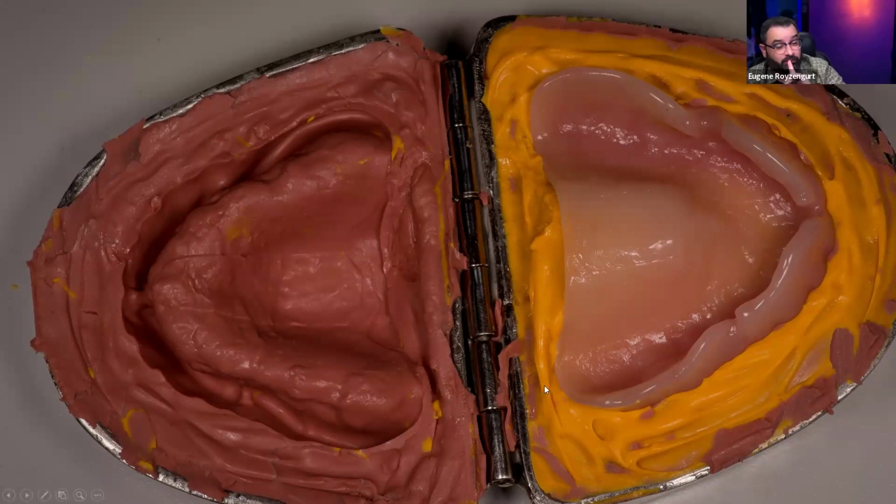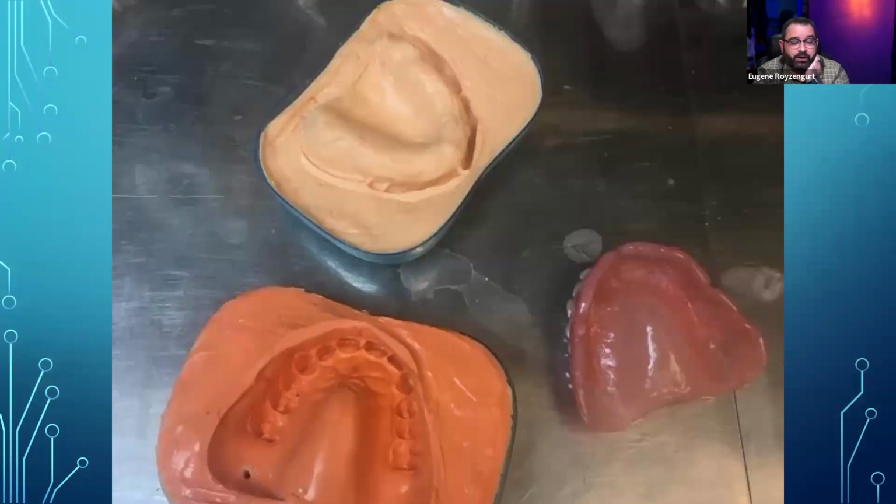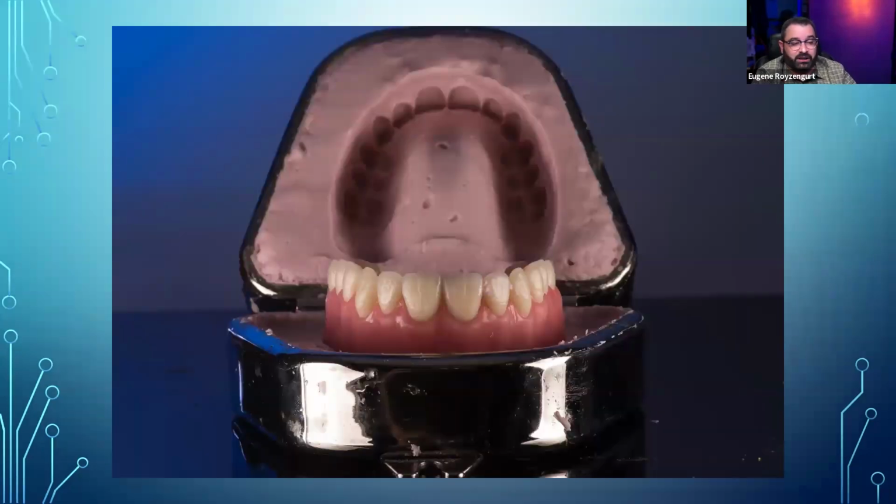Important thing to remember if you guys are still doing it that way, make sure you put some kind of separator between the layers of silicone, because if it gets stuck together, it's really hard to take it apart. But this was one of the ways of doing it. This was another way. I was using one of these flasks. I think this one is from Fast Pro Tech. I've done it using soap dish cases. I've done it with those flasks using alginate.